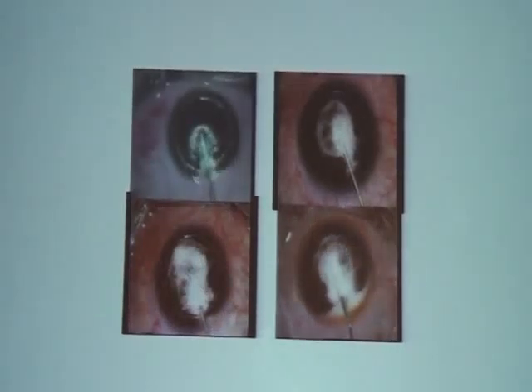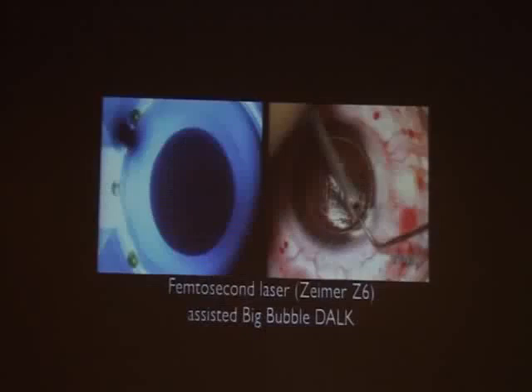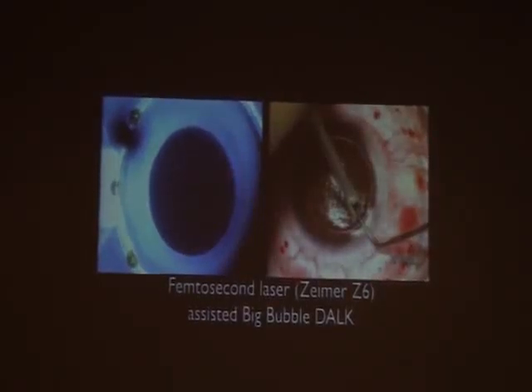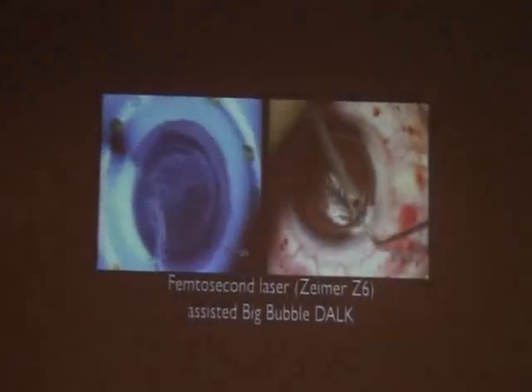Just to show you the different cases, most of the time after a while you start getting it very consistently. And even with the femtosecond laser, you can do that. It's an expensive way of doing it, but if you have this tool, no harm in using it on your patients.